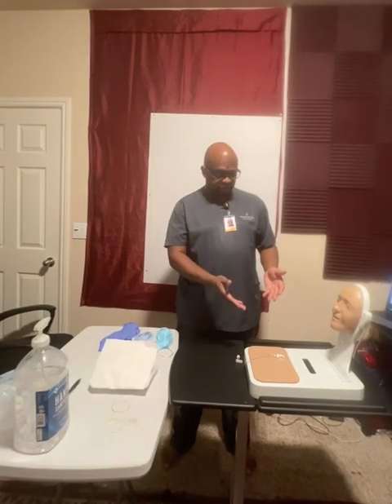Hello everyone, my name is Robert. I'm a nursing student for Nightingale College. Today I'm going to be performing a video skill which is changing a central line dressing.